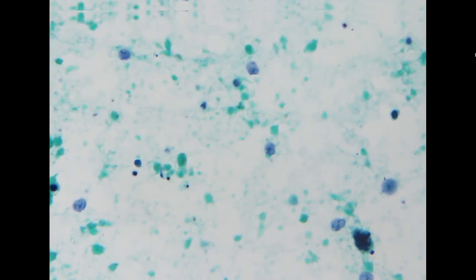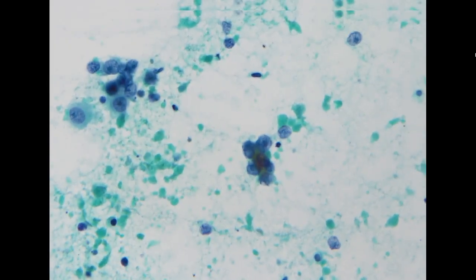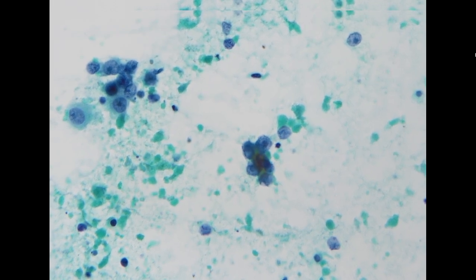If we see this necrotic pattern, we will suspect that the patient may have metastasis. This very dirty prominent necrosis is most commonly seen in metastatic colorectal cancer.